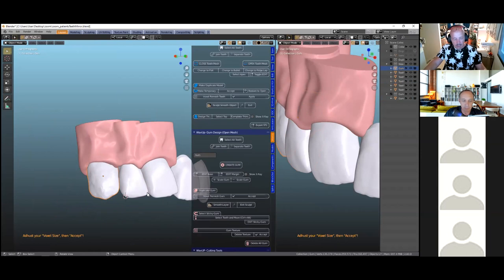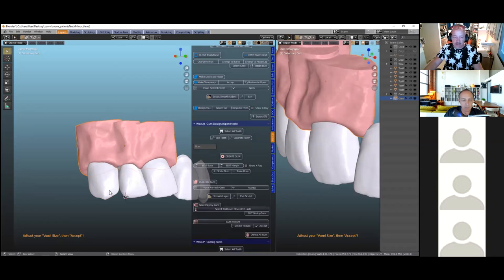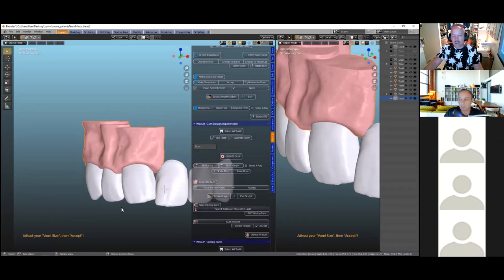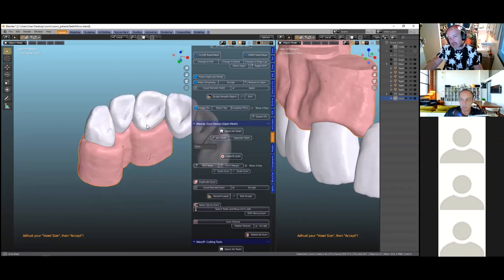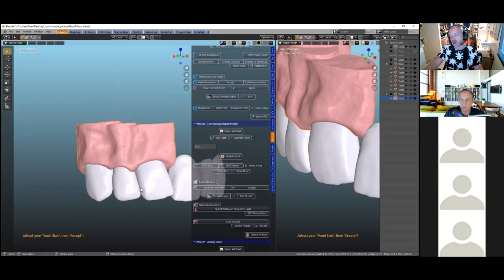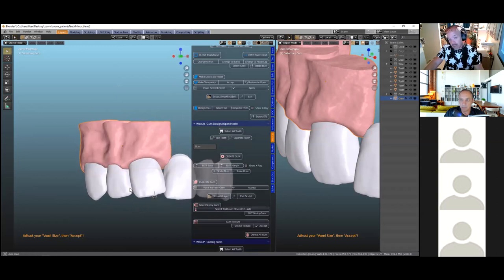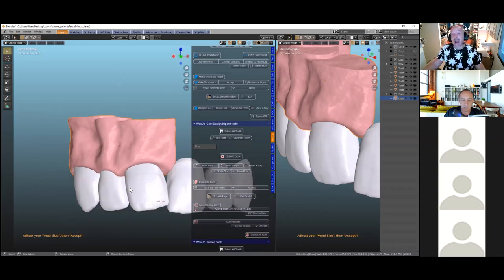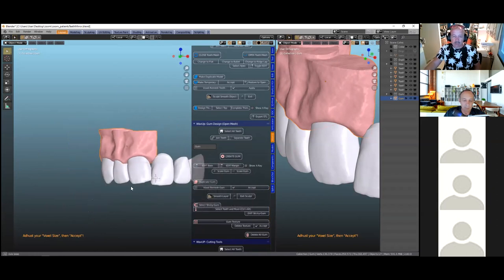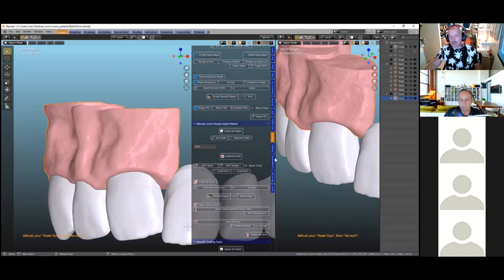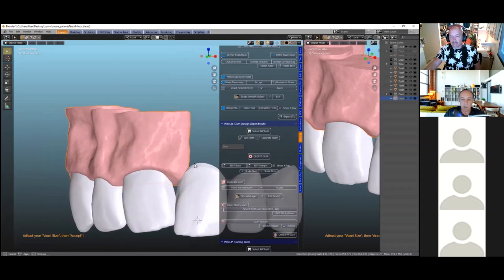We can add texture to it. We exit sticky gum, click on 'gum texture' and it applies a texture. In Blender there are many different textures and you can make your own. This uses a cloud texture. We can accept it — very fast to create.